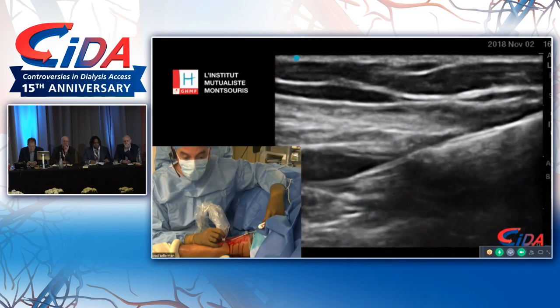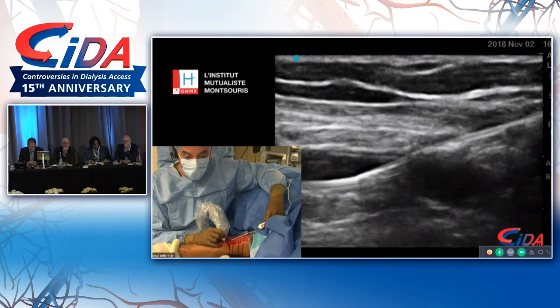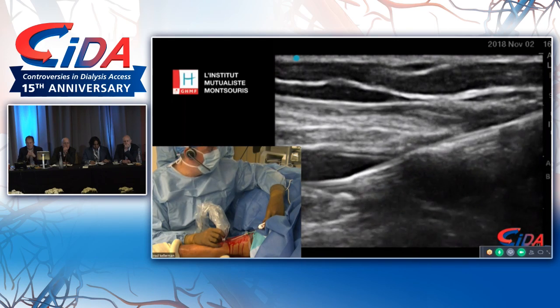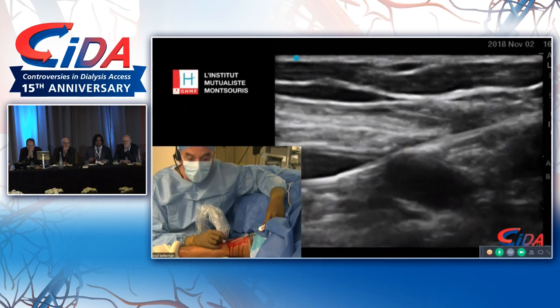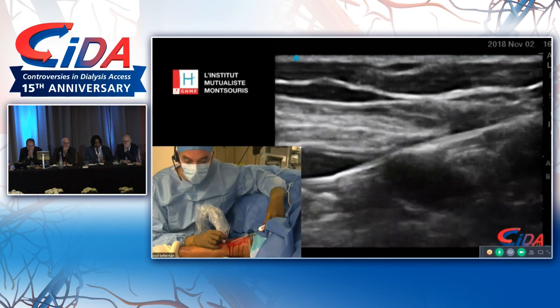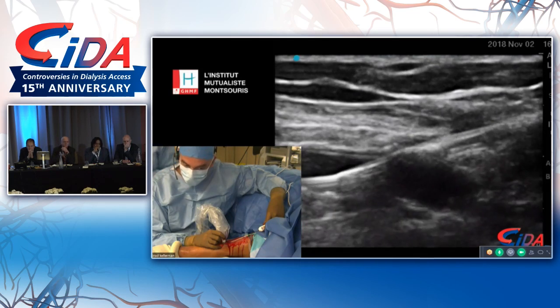We have the anterior part of the wall, the superior wall of the artery and the inferior wall of the vein grabbed between the two plates of the device. The reading is 0.5. The generator gives us a reading of the distance between the two parts, which essentially gives you an indication about the amount of tissue that is grabbed, which is perfect, 0.5.